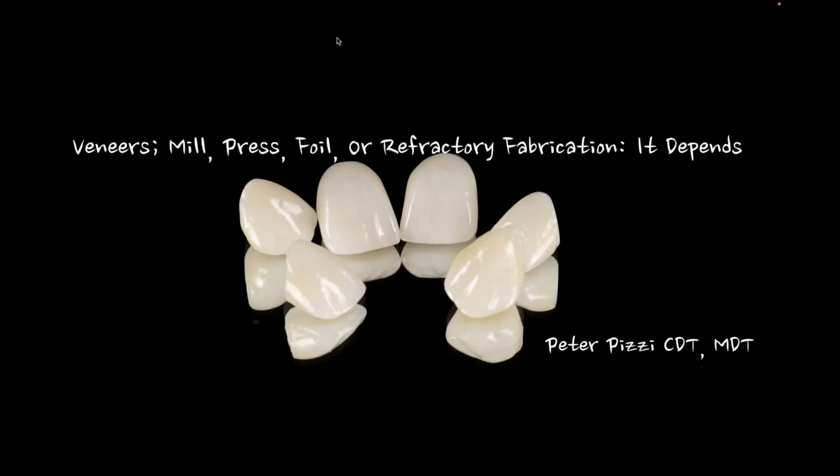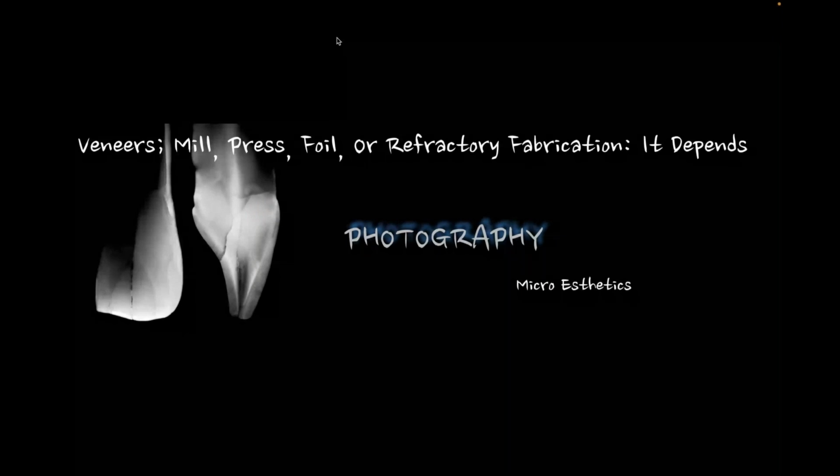I think to me, veneers are probably still one of the most aesthetic and best options, right? Minimally invasive and so many different materials to choose from. So the way Jim worded this, I think he really wanted me to talk about different materials and how and why. So let's first start with some of the keys.